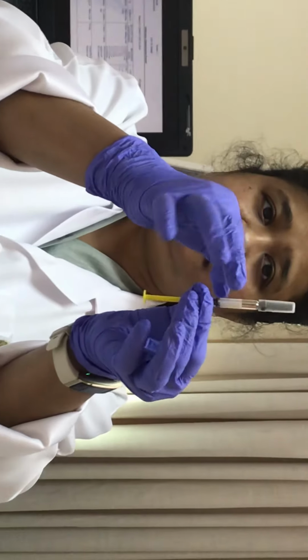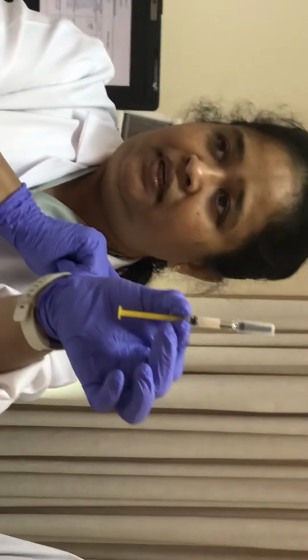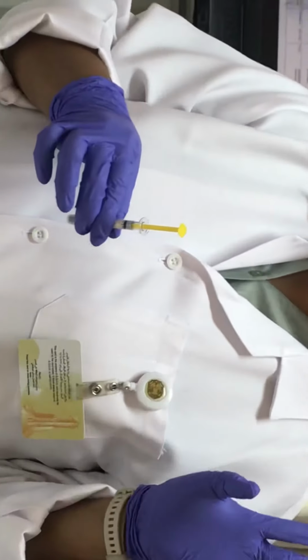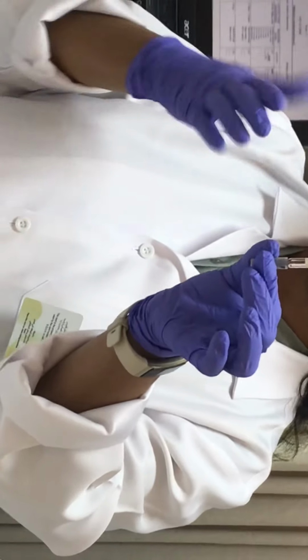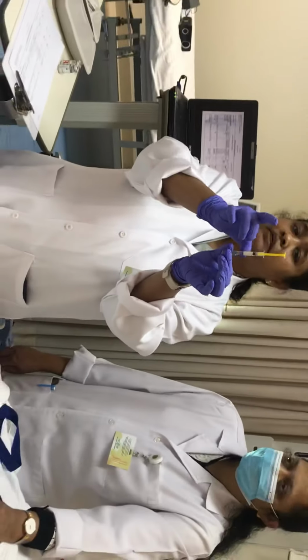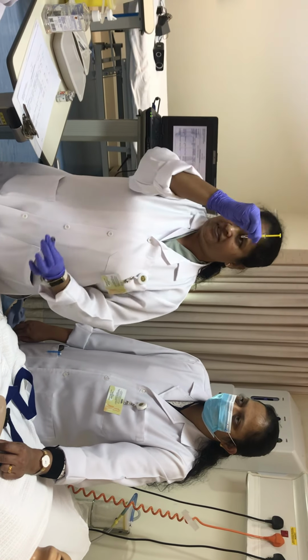Okay, you will find there is one air bubble there. Do you see that air bubble? According to the company, the air bubble should also be given. We are not supposed to give an air bubble for any medication, but only for heparin. You need to give the air bubble at the end of the medication. That is to seal. They don't want even some medicine to come out. So keep it like this so that the air bubble goes up, and remove it this way.